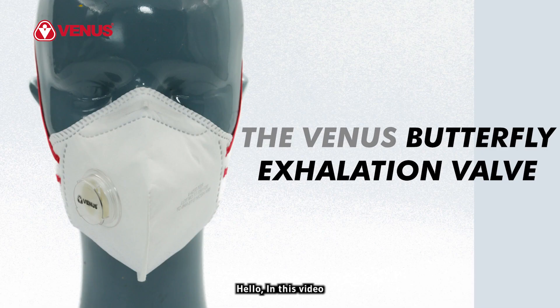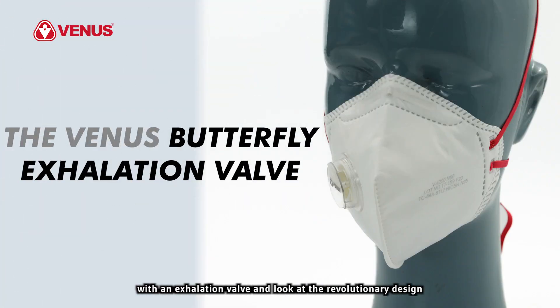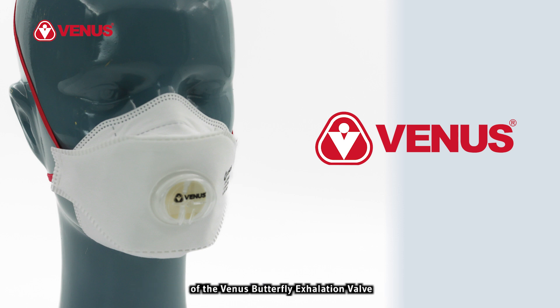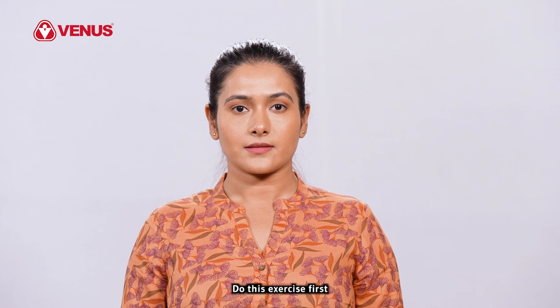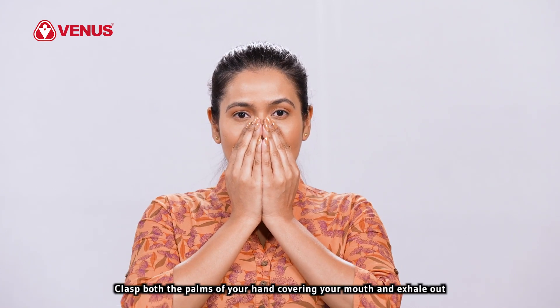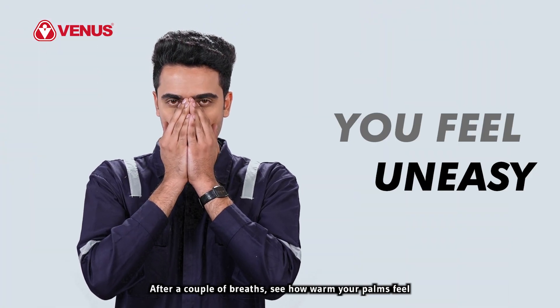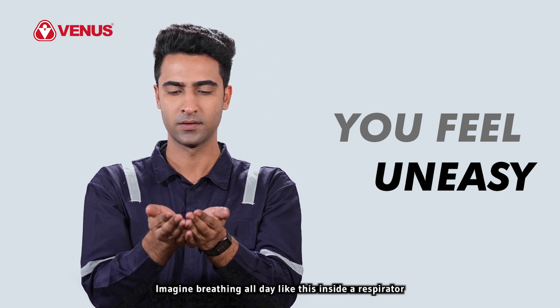Hello. In this video we shall look at the advantages of wearing a respirator with an exhalation valve and look at the revolutionary design of the Venus butterfly exhalation valve. Do this exercise first: clasp both the palms of your hand covering your mouth and exhale out. After a couple of breaths, see how warm your palms feel. Imagine breathing all day like this inside a respirator.